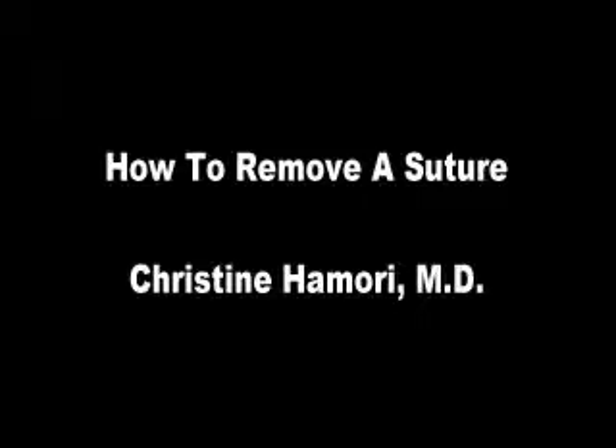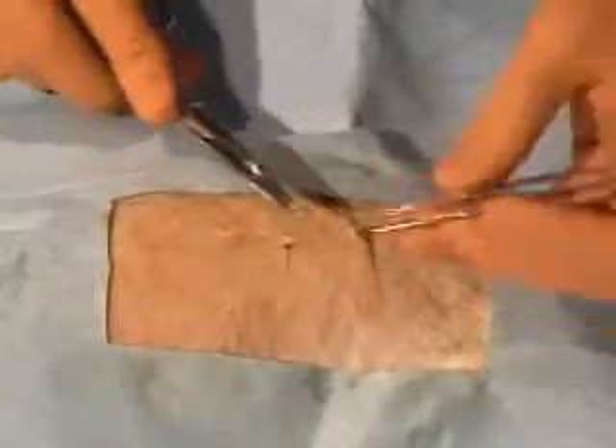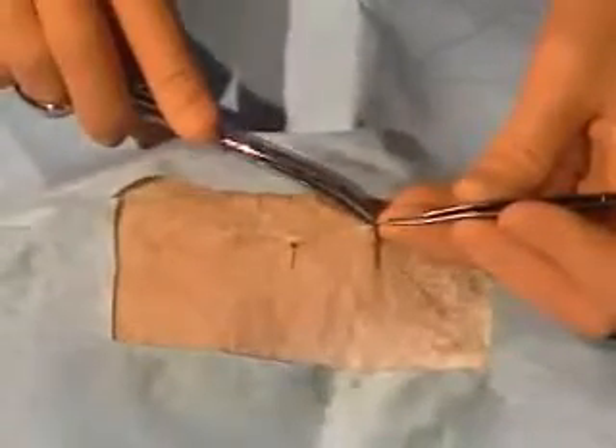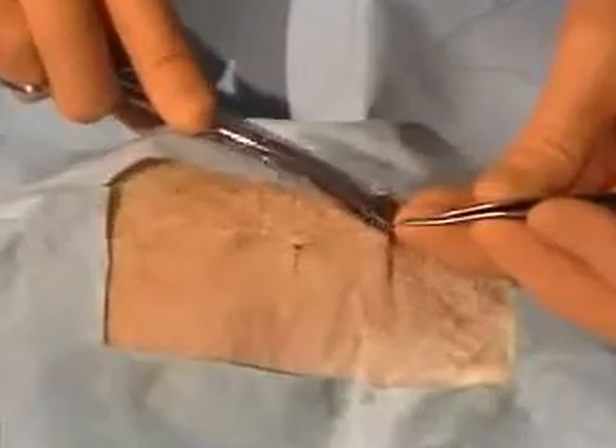When you want to remove a stitch — no one ever shows you this — you want to really pick up the edge, and you don't want to cut off the knot completely. You just want to cut one limb of the suture and pull out the whole suture. Some people don't understand that, because if you just cut off the knot completely, the suture stays in the patient and there's a chance for infection.